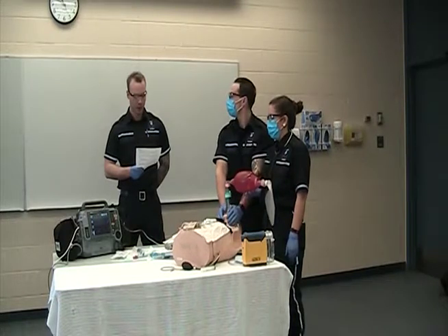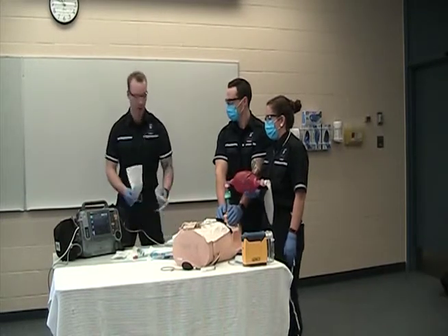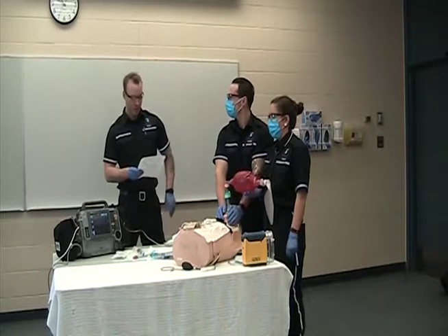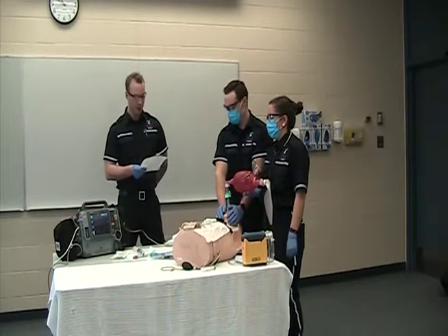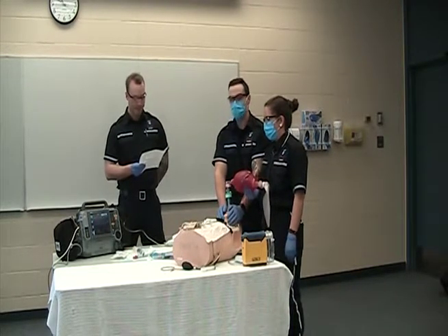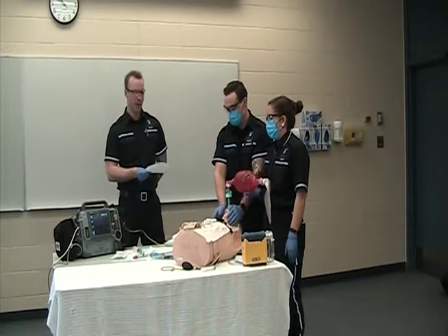Laryngoscope has the appropriate blade. In this case, we're going to be using a 3 attached to the blade, and we're going to also make sure that the light is on and working. ETT, as previously stated, we have our ETT. EDD, rescue airways, cric kit, basic airways, HEPA filter, open and prepared. Capnography initialized and working. And ETT holder under the patient's neck.